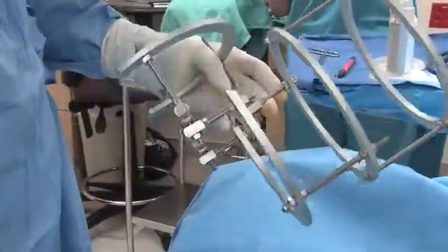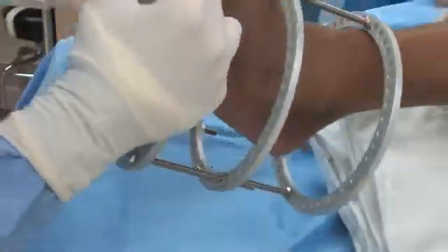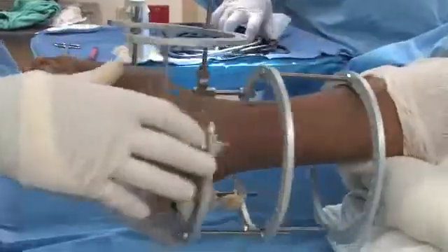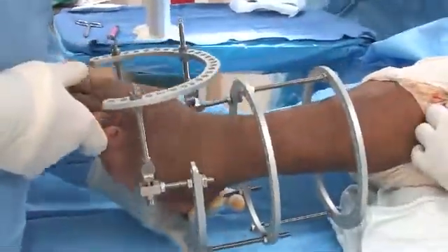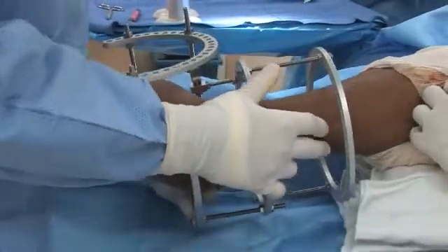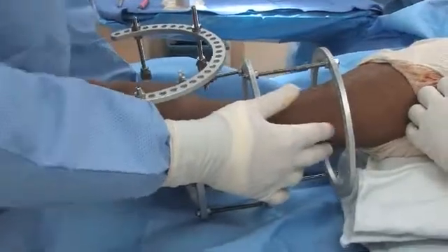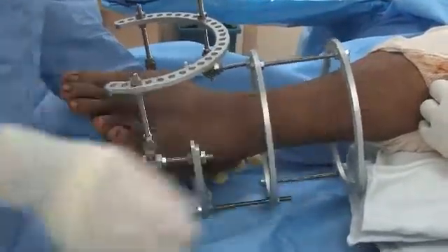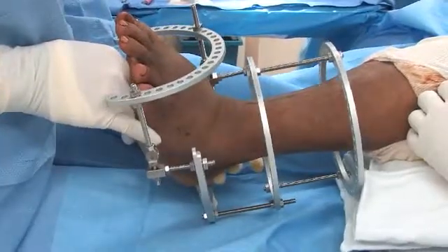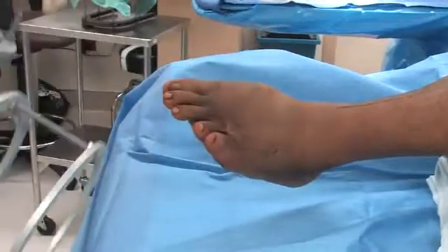So we'll just trial fit the frame at this point. And so the gap between the skin and the leg all the way around the tibial ring block looks good. There's not going to be any impingement there. Okay. So what we'll do actually is I'm going to remove this forefoot ring. It's going to be in my way at this point.